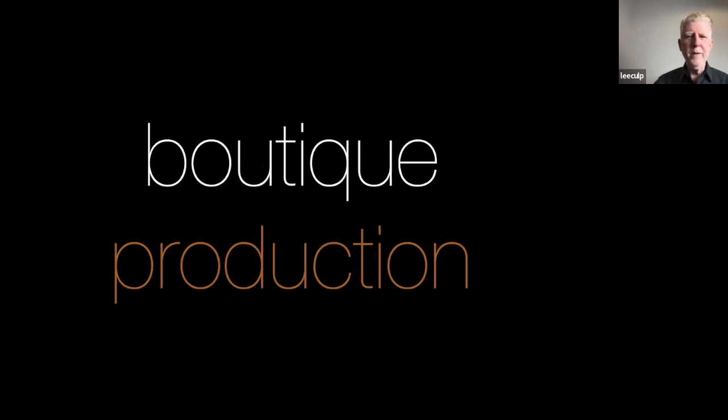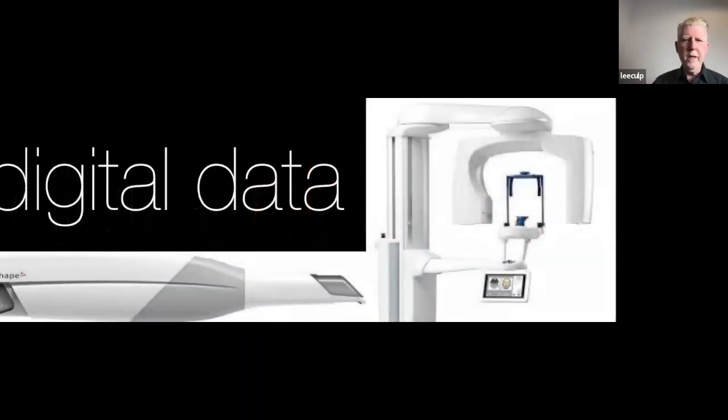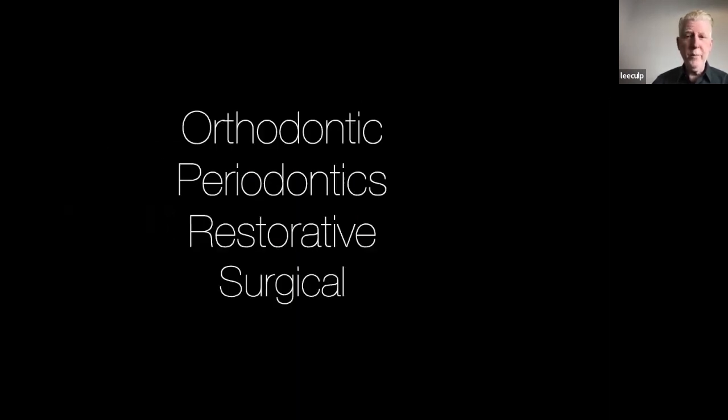And the things that we can create and the amount of work we can do on a daily basis. There we go. So let's move into digital planning. These are the data sets that you're very aware of that we need: intraoral scanning and CT. With those two data sets, literally we can do pretty much anything you can think of. We do a lot of orthodontic work here, at least visualization. We do a lot of perio work here.